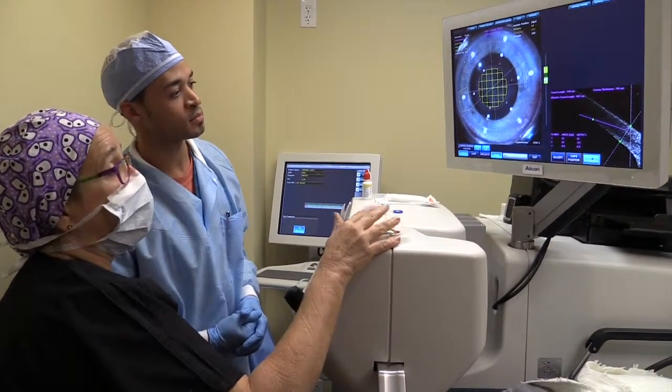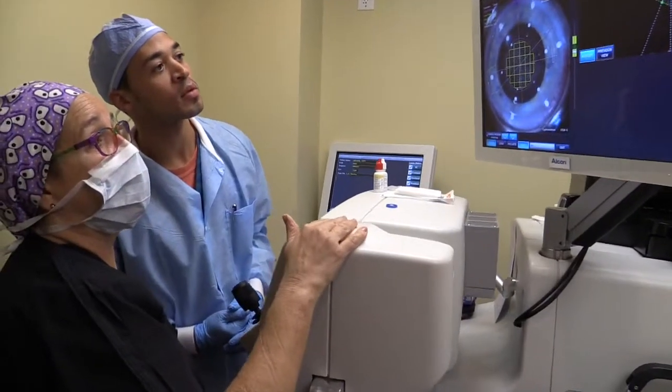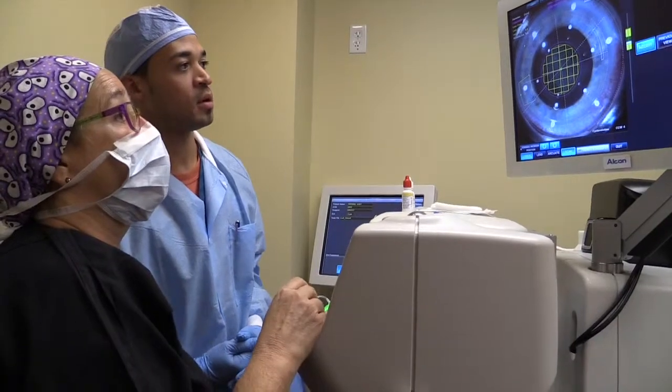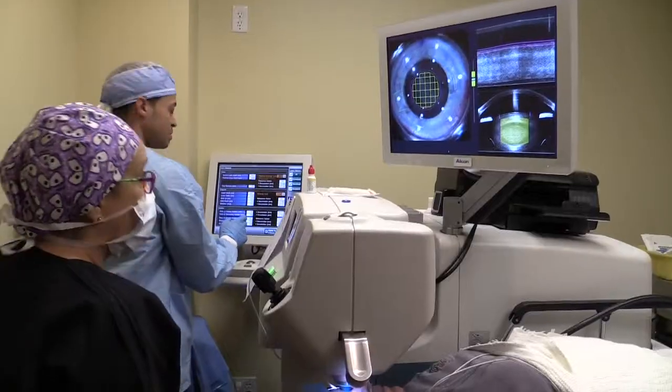And we're going to now look at where we're doing our correction for the astigmatism. Let's take a look at this, and we can see up in here, I'm happy with that. Are you happy, Russell? Yep, that's good. We need a little more pressure on our eye, so let's just bring that up a little bit. Okay, so now I have accepted, and I like everything, and I am happy with what we have, so I'm verifying accept. The laser will now be ready in just a minute.